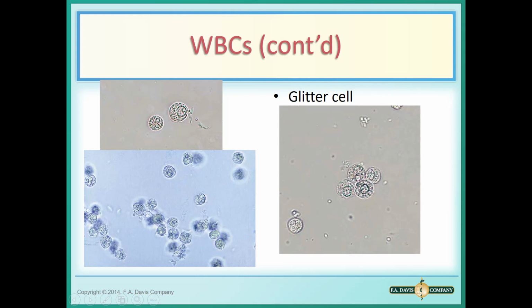We're going to look and see. These have very distinct nuclear material here. Sometimes we can do this with stain. And if you remember, I talked about in lecture on Tuesday how we can also do this with acetic acid. That will bring out and enhance the nuclear structure. Remember, though, number one, we don't add acetic acid directly to the original specimen.